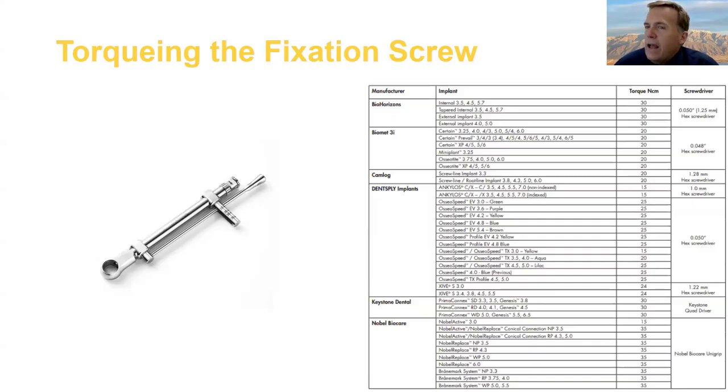Again, if you're using an angled screw access, it's going to use a different driver, so make sure you have that driver ahead of time. And the third thing, which is a little bit of good news, is a torque wrench is an instrument to apply rotational force. So if you can get the correct tip that will fit in your driver, you can use one torque wrench with a variety of different implant systems, because these are not free. So as you know, that helps a little bit.